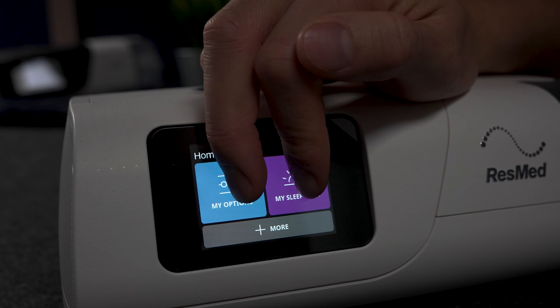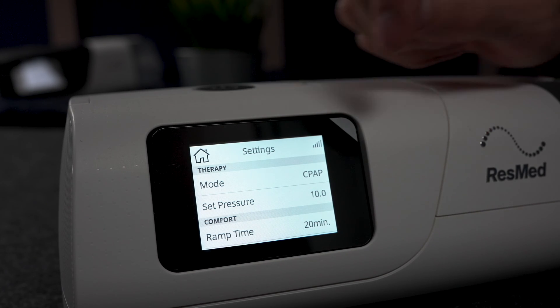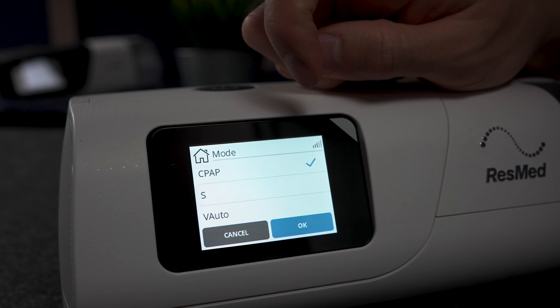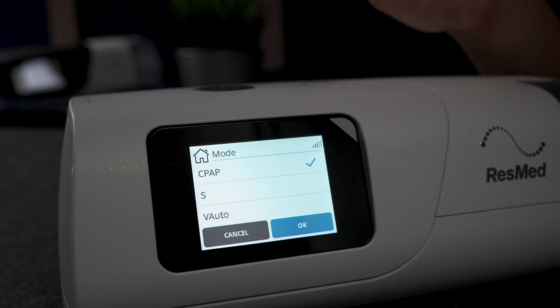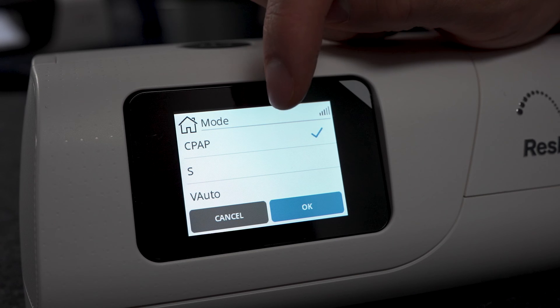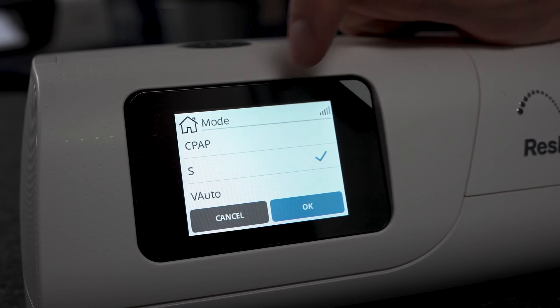We're going to go to the clinical menu and click settings. Under mode, we have CPAP mode, S mode, and V-Auto. CPAP mode is just standard CPAP — you might as well buy an AirSense 11 at that point. S mode is a fixed-pressure bi-level mode, and V-Auto is the automatic bi-pressure mode. We're going to click S first.